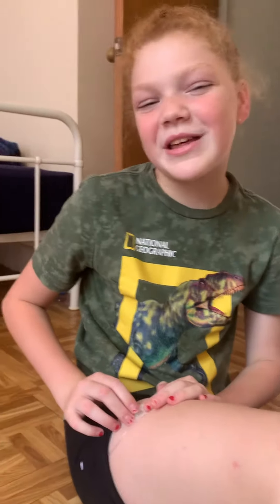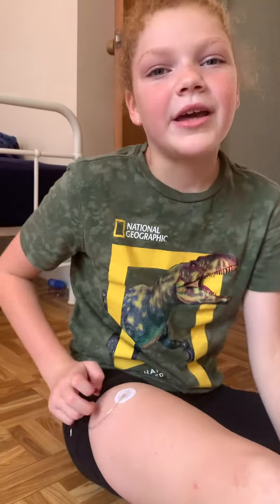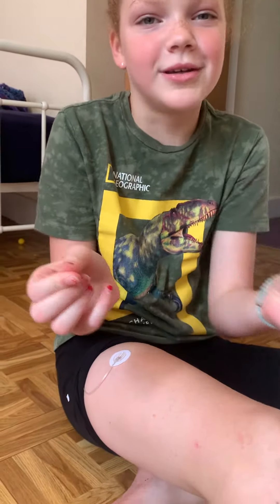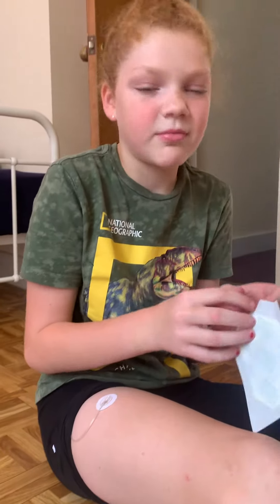Hey guys, so today we're changing my Tegaderm because I got really sweaty while playing and I'm going to go in the pool soon. I took off my Tegaderm already and balled it up — it was really just coming off.